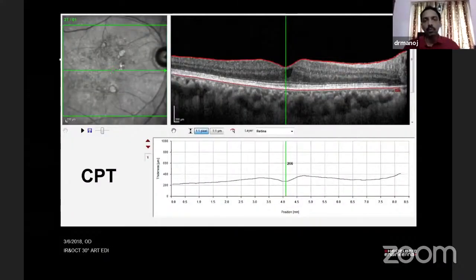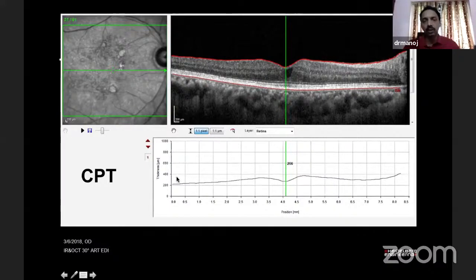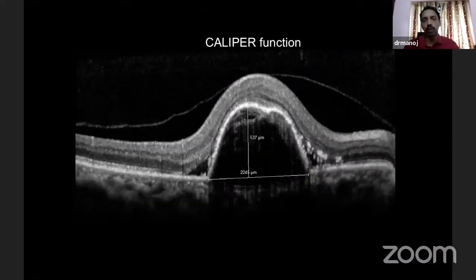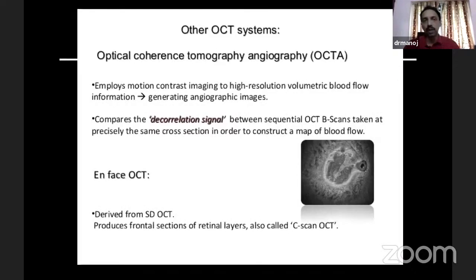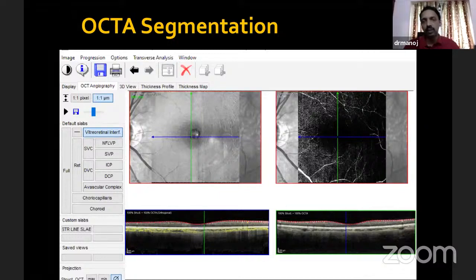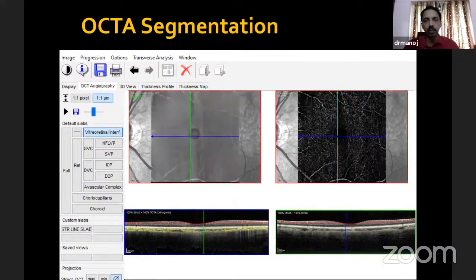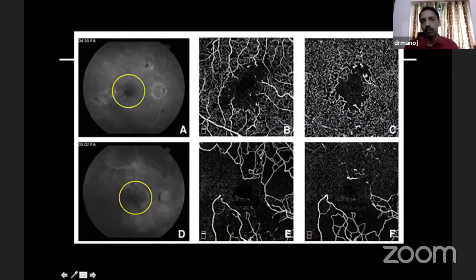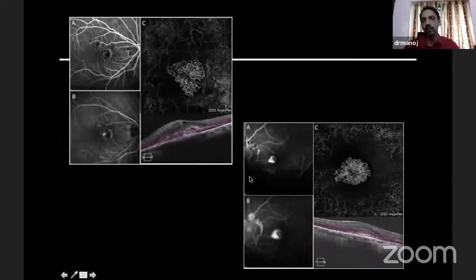It is also possible to measure thickness in patients — on the OCT, you can measure the thickness; there are nomograms available which help in follow-up of these patients. You can use a caliper or inherent modes by which the thickness is measured. Nowadays we also have OCT angiography, which helps us study the retinal vascular layers — the superficial capillary plexus, the intermediate capillary plexus, and the deep capillary plexus. This is very helpful in studying diseases like diabetic retinopathy, where the foveal avascular zone is obviously affected, and in identifying CNVMs.